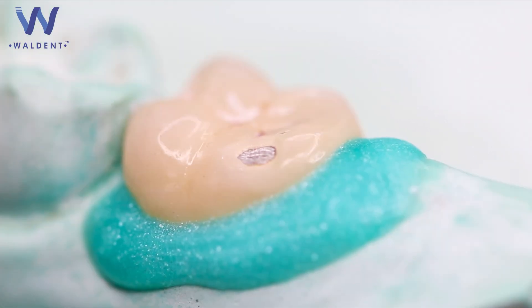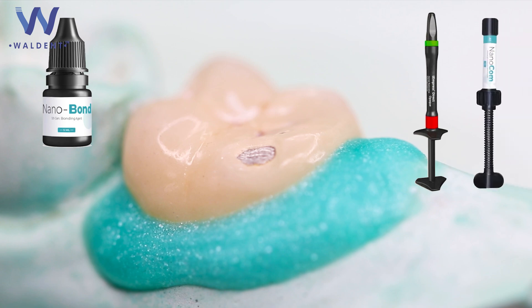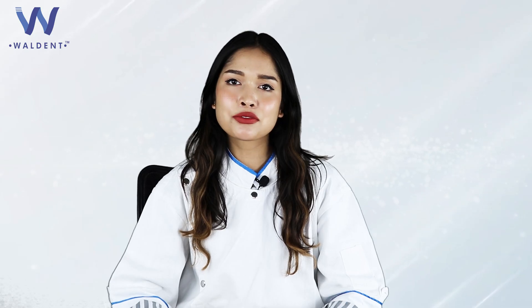Do not rinse. After etching and priming, the crown surface is ready for applying bond adhesive, an opaque if required, followed by composite restoration.